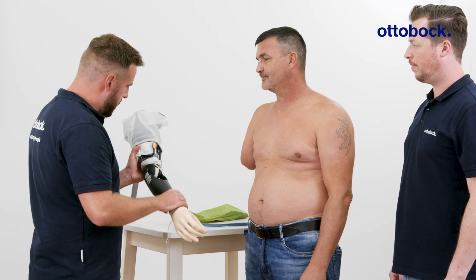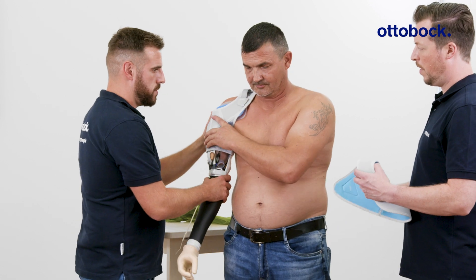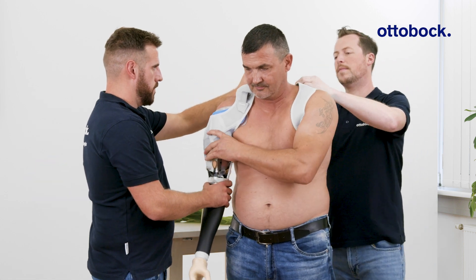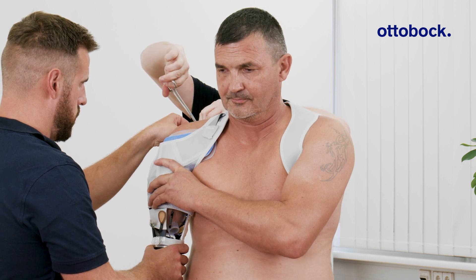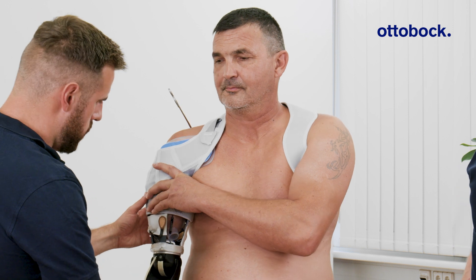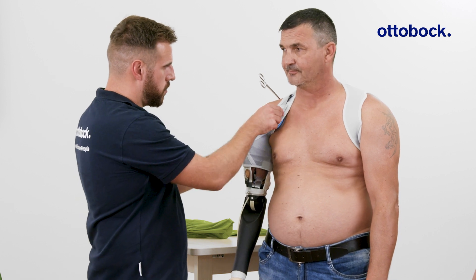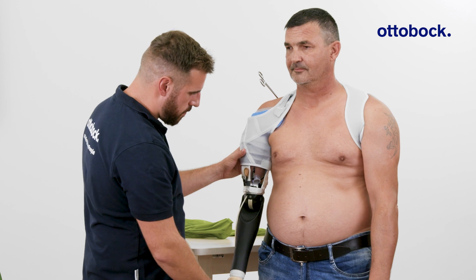Next, the test prosthesis is assembled to simulate loading conditions. Position the transhumeral soft harness to secure the prosthesis to the upper arm. Adjust the harness as needed and assess the fit and pressure distribution while the elbow is flexed.